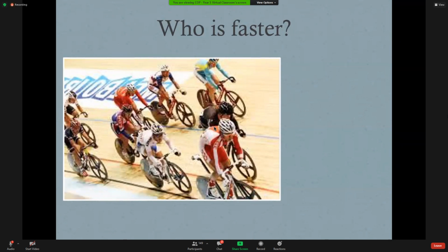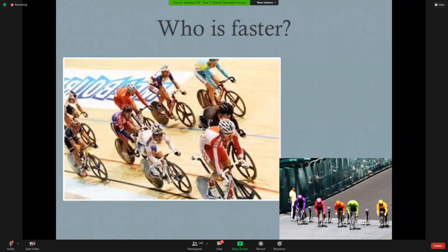So a single snapshot of different people can be used as a concept to understand how getting different frequencies from different resonance waves from the different protons in the body, without having a baseline, so without knowing where they were starting from, can be misleading, and therefore actual image interpretation or image formation is not possible. And the best way to do that is actually to make sure that they are all aligned together. And then I know they have started at the same line, I know the distance, and then I could actually record the motion and see who will be the faster one.